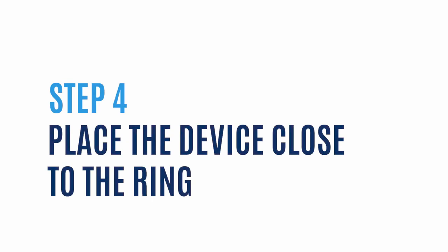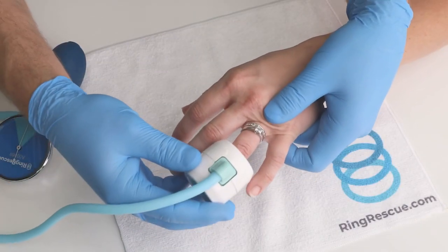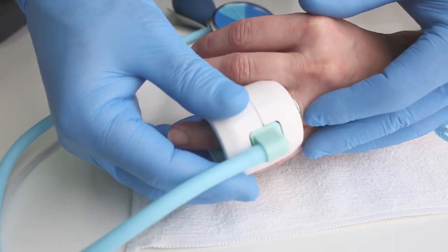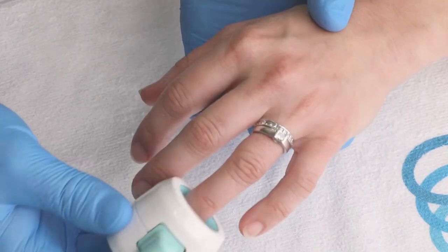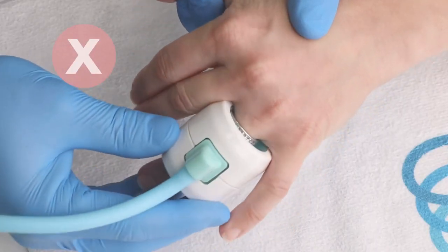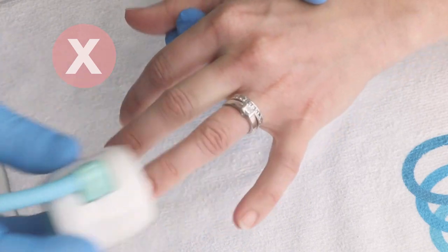Step 4: Place the device close to the ring. The device should be over the area of maximum swelling. Place as close to the ring as you can while ensuring the device is not over top of the ring. This can impact the effectiveness of the device and could puncture the internal bladder.